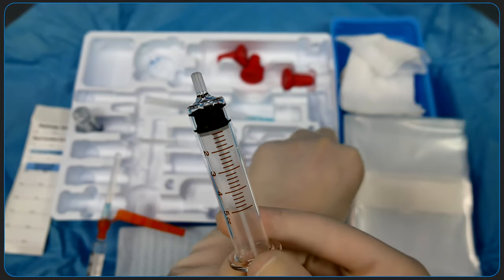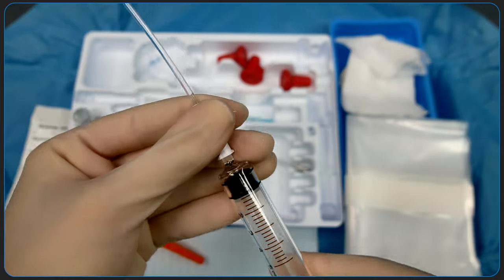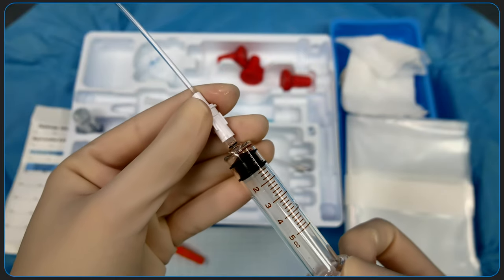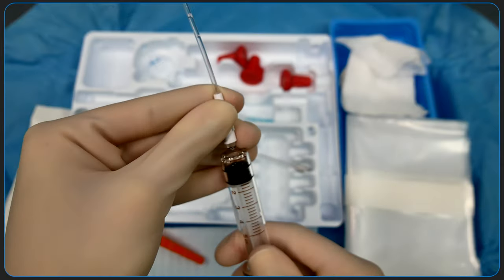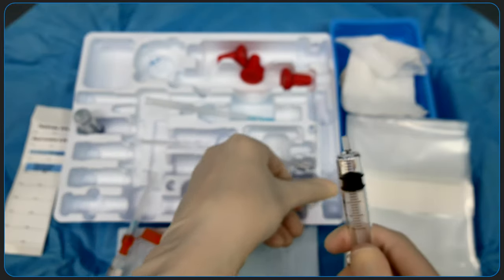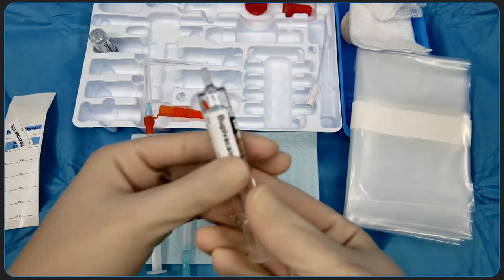If the kit does not have the spinal local anesthetic desired, you'll need to obtain that and draw it up sterilely. Your assistant or attending can open and hold the vial for you to draw it out of. Always confirm that you have the correct medication. At our institution for orthopedic procedures, we use preservative-free bupivacaine 0.5%. And be sure to check the expiration date.